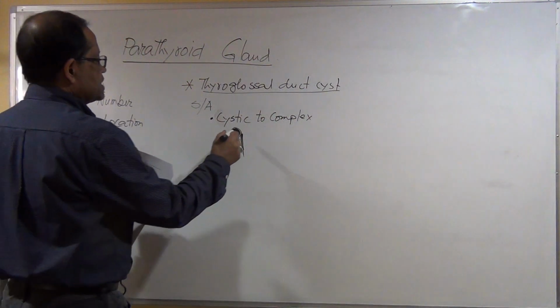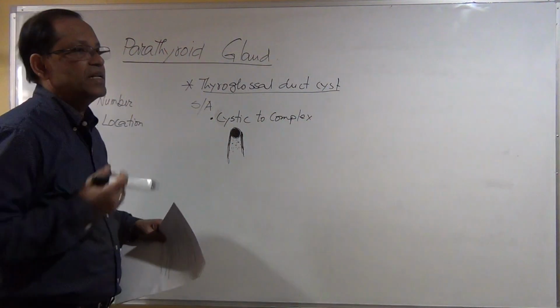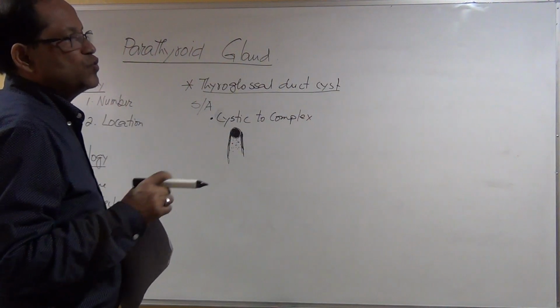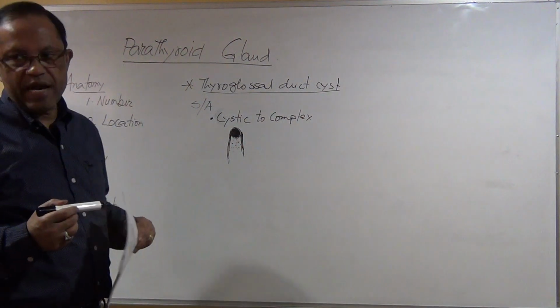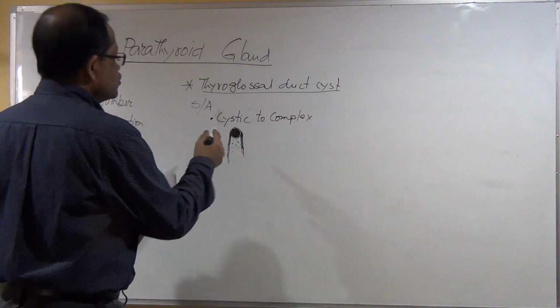You can see the cyst in the midline. It is so superficial that it will be appreciated if you use a stand-off pad.